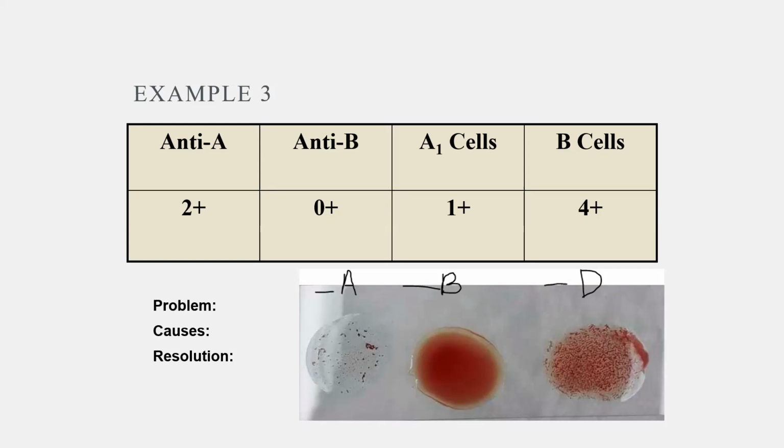And then we also have anti-A1 lectin, which may or may not be in your reagent rack now. I don't know if you guys have seen anything about lectins yet. Lectins are basically antisera made from seeds. And it's kind of weird because it's like, how did people know? Did they just test a bunch of seed, milk, water with a bunch of cells and see what happened? Because we have a lot of different lectins that we know about. So it's kind of cool.